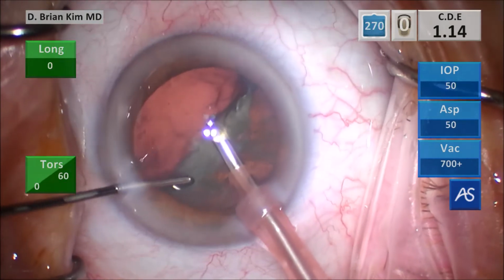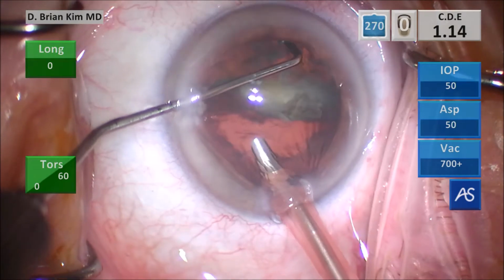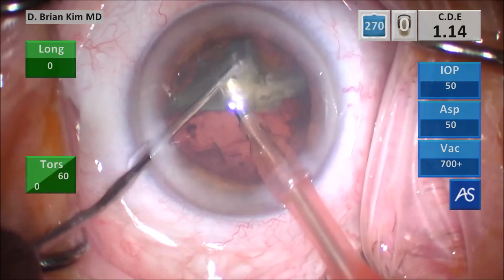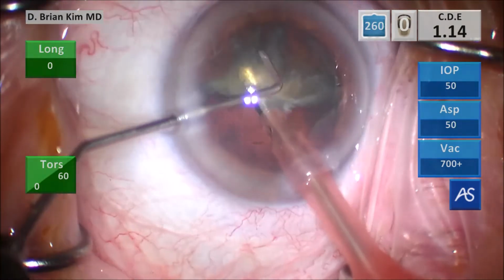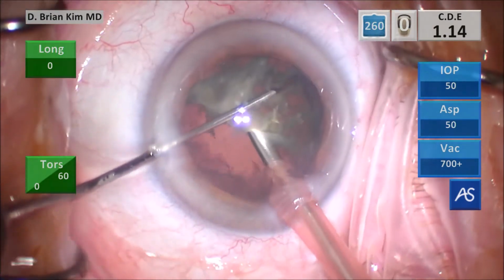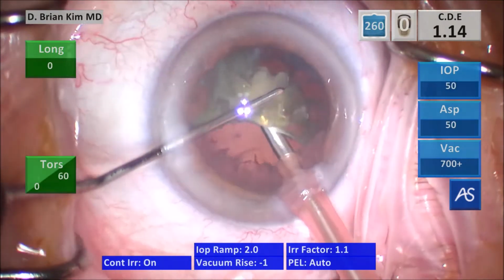Just going to rotate that second heminucleus in front of me, placing the chopper underneath that lens piece. Careful to make sure I'm under the rhexis edge, making sure I've hooked it well, pulling it centrally towards the phaco tip, and then dividing that lens. Placing the chopper under the third quadrant, making sure I'm under the rhexis, hooking it, and you can feel when you hook it because the lens stops, and then you can push it against the phaco tip and you can feel it start to fracture.